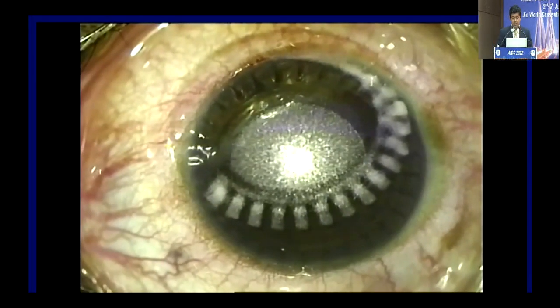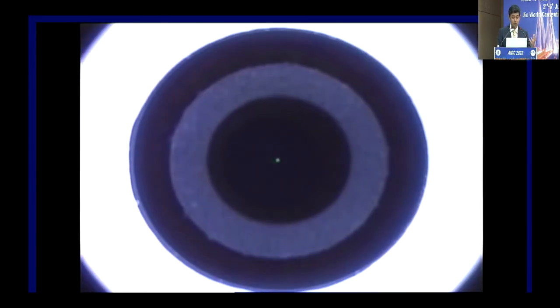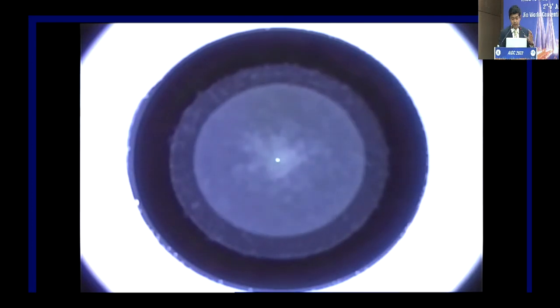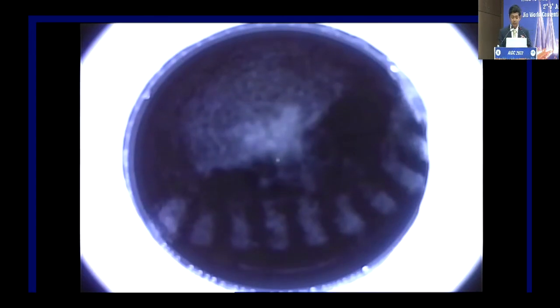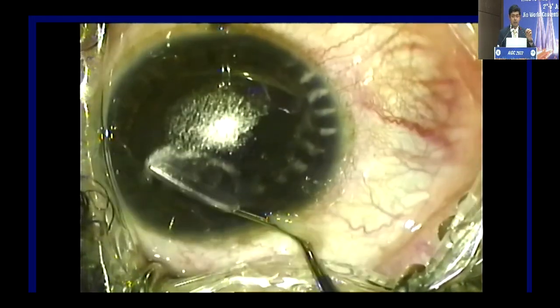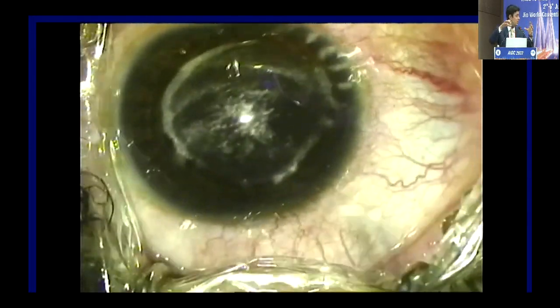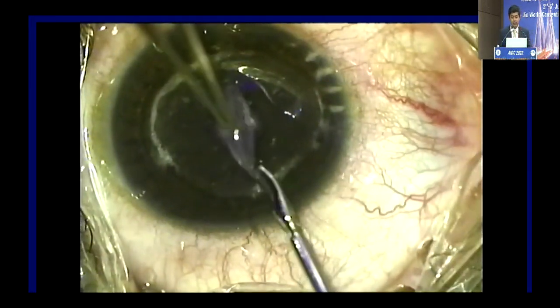So I went ahead, and for the second eye, I was a little more cautious of the fact that this could happen. The patient, for some reason, had almost an exact suction loss at the very same time. But fortunately, when this suddenly happened, I took my foot off the pedal. So I was able to go ahead and just make the incision cut. Mind you, during this incision cut, it's important that you get correct centration, but you now have a full ring available. So you can just center it on the ring which is already there. Even if you're not able to visualize the pupil, the ring is very much visible. So it was very easy.